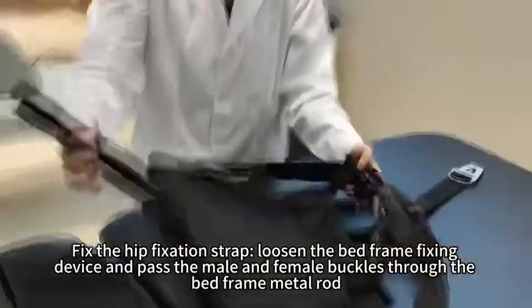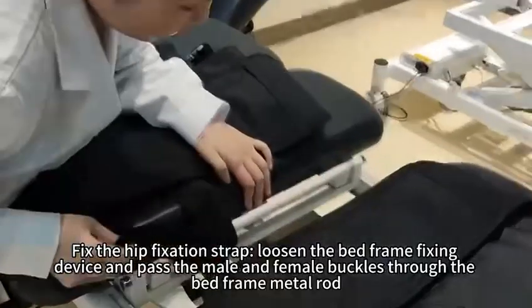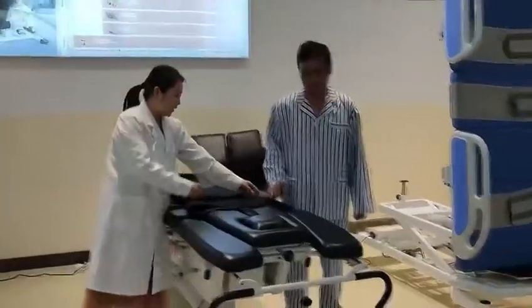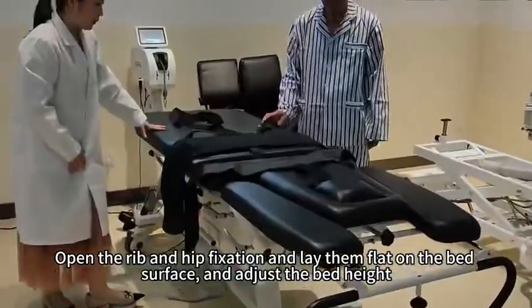Fix the hip fixation strap, loosen the bed frame fixing device and pass the male and female buckles through the bed frame metal rod. Operation of traction bed. Open the rib and hip fixation and lay them flat on the bed surface and adjust the bed height.